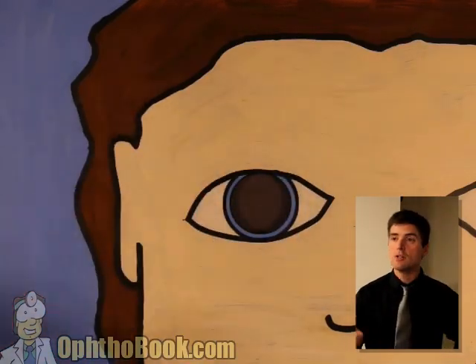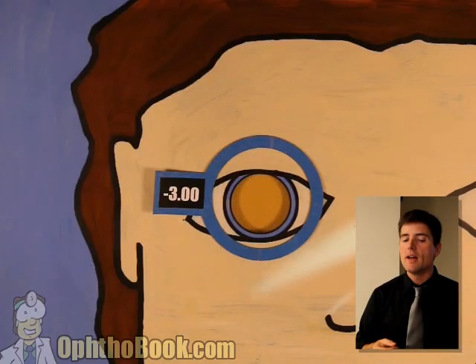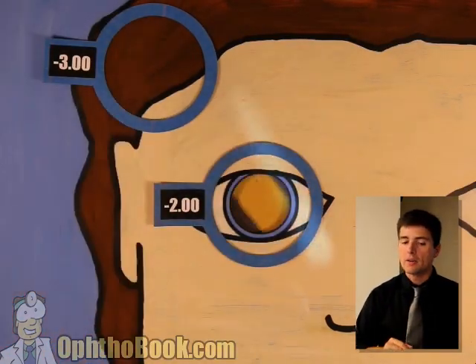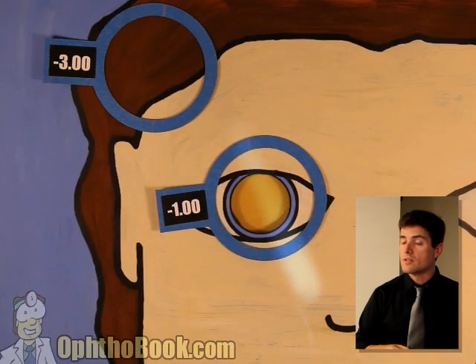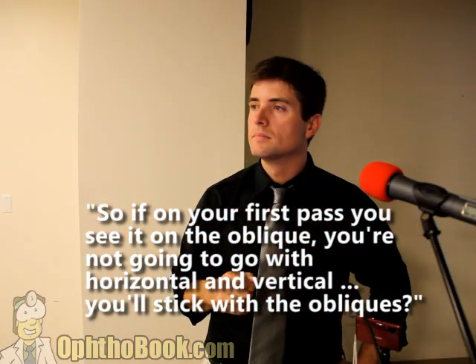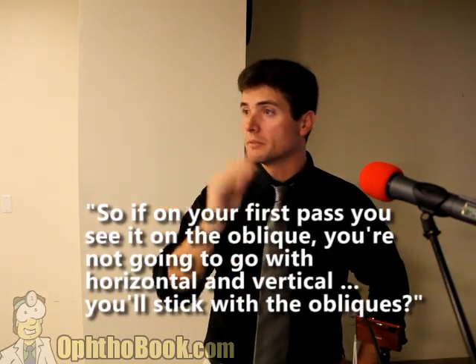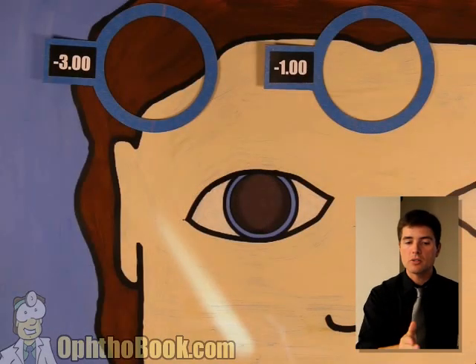Now we continue with our standard retinoscopy technique — step two, we start adding power. We add a diopter. Not quite there. We may be close the other direction — perfect, we've got it. We've got the prescription that way. Take that lens and set it aside. Keep adding power until you get the other direction. We're getting close — not quite there yet. Let's add another diopter. I think this is it. Set the lenses aside. This is a minus three plus two. You look at your axis — if it's not obvious, hold it in front of your phoropter and look at the angles.